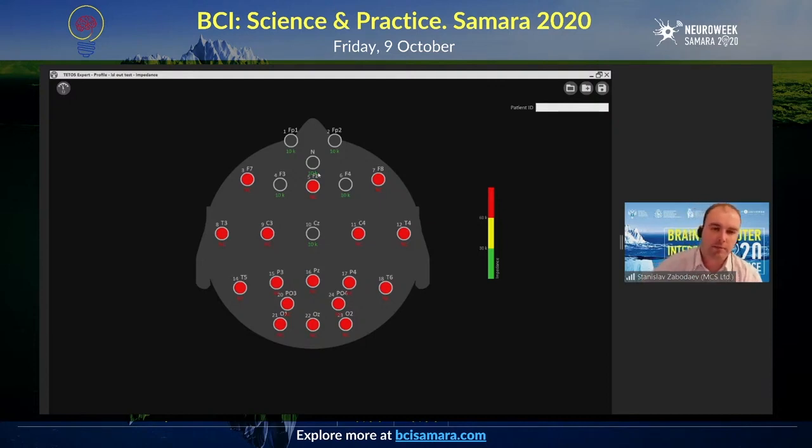That's not something that we need for the demo, but if we want to use a direct current stimulation between FP1 and FP2, then we just do the addition of 10 kilo ohms to 10 kilo ohms. Therefore, we have the impedance set at 20 kilo ohms. Therefore, we cannot use 4 milliamperes to stimulate the brain.